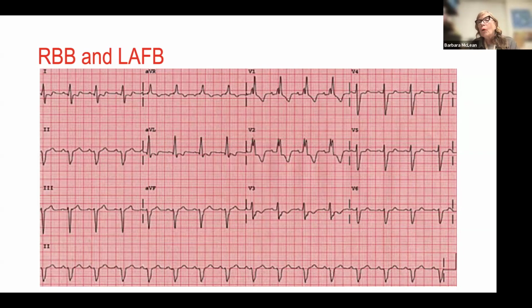Now, why is this important to me? Because if I have a patient who is having ongoing chest discomfort, who's evolving a STEMI, they have only 1 fascicle left, and that's their posterior fascicle. They block 2 fascicles, so complete block to the right bundle, and a loss of left anterior fascicle, only the posterior fascicle remains intact. So I, as a bedside nurse, am going to be acutely aware of this. I don't need to call everybody in about it.